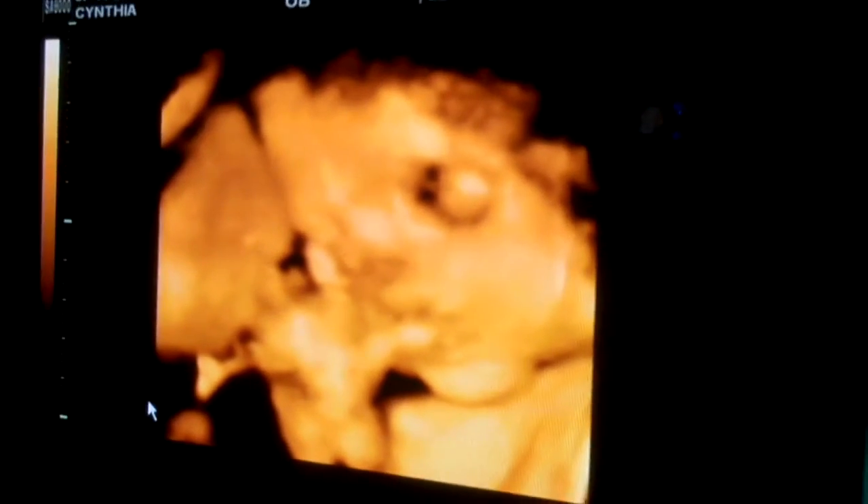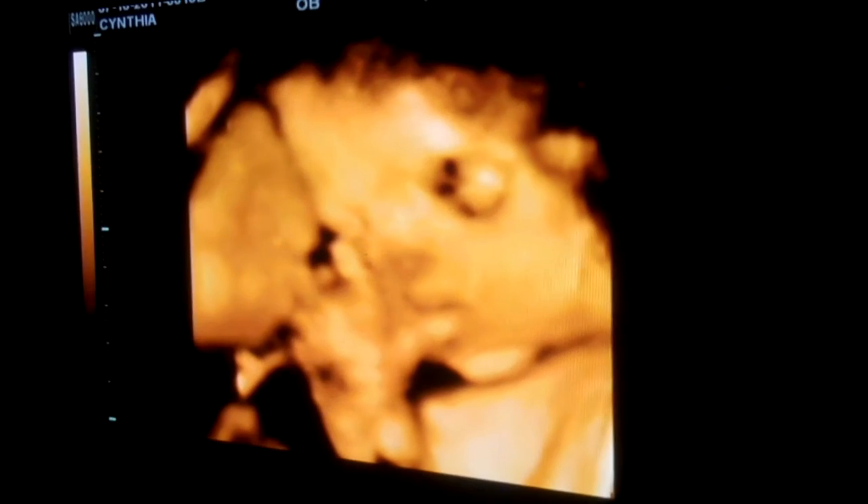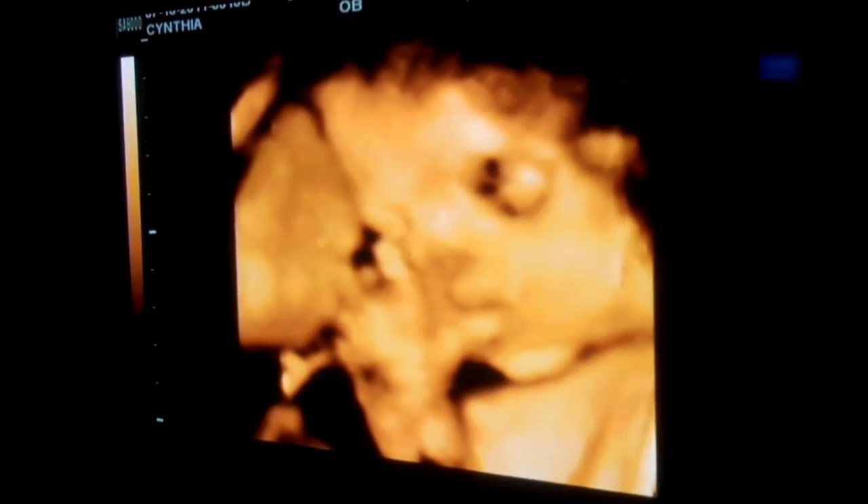She's going to come out. That was the first time I've seen that look so clear like that. That is cool. Looks like she's got her forefinger up. Let's see if we can do a better view — I'll save that for you. She has hair.